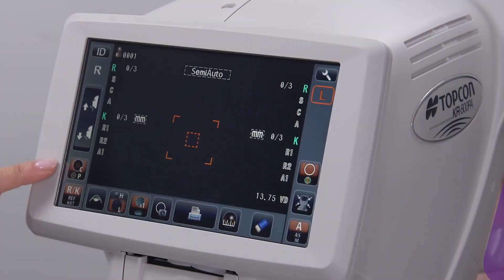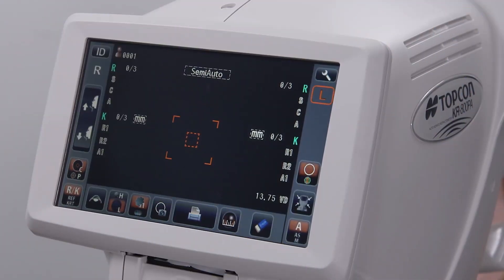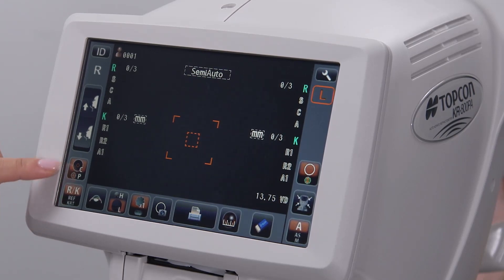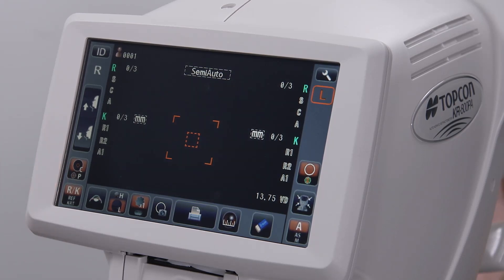The CP icon determines where keratometry values on the cornea will be measured. When the icon below it is set to keratometry, C will have the data acquired more centrally, while P will have the data acquired more peripherally.